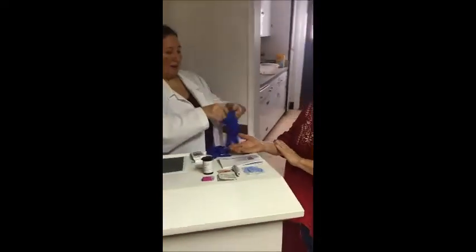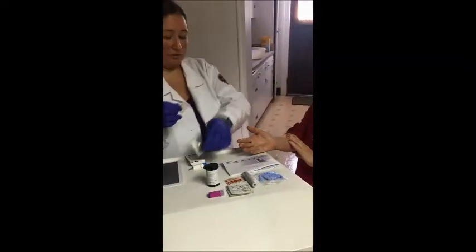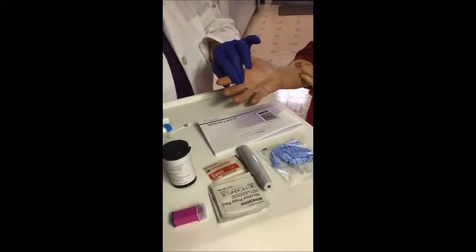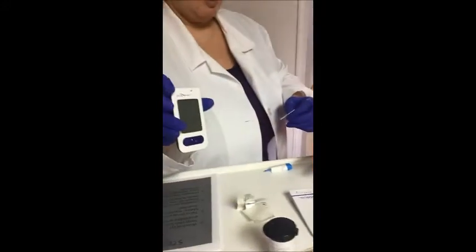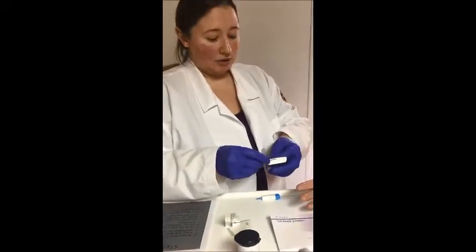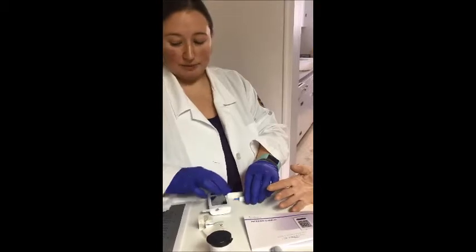Now I'm going to show a patient how to properly check their own blood sugar. First, you would want to clean your finger. We'll use this alcohol prep pad. You'd want to make sure that you turn on your glucometer. Sometimes glucometers turn on when you insert the test strip. It's best if you can use the patient's own glucometer so that they're familiar with their own equipment.